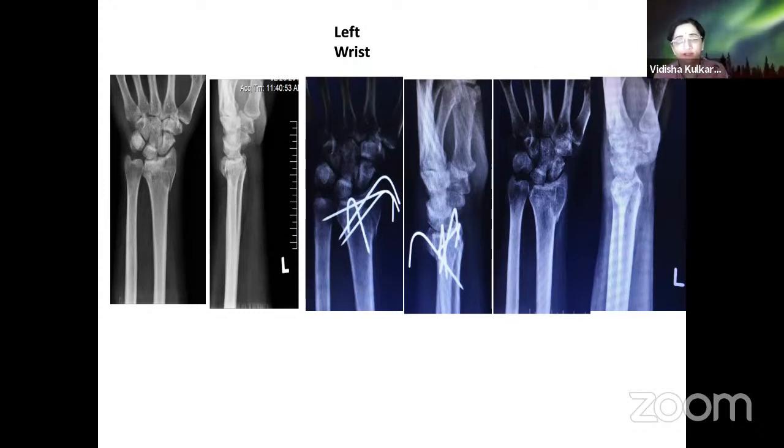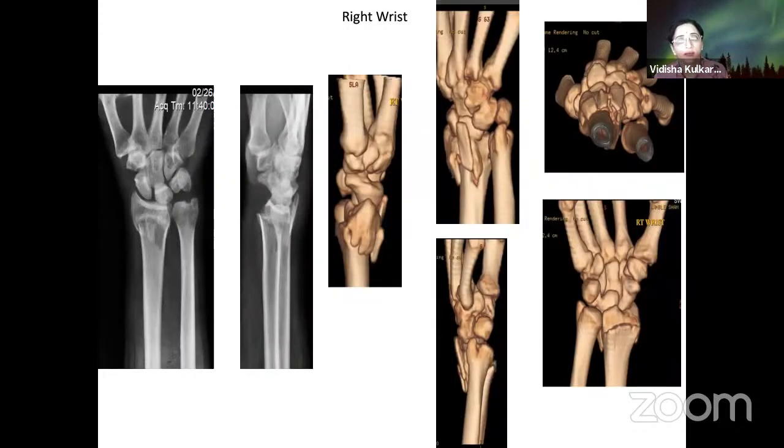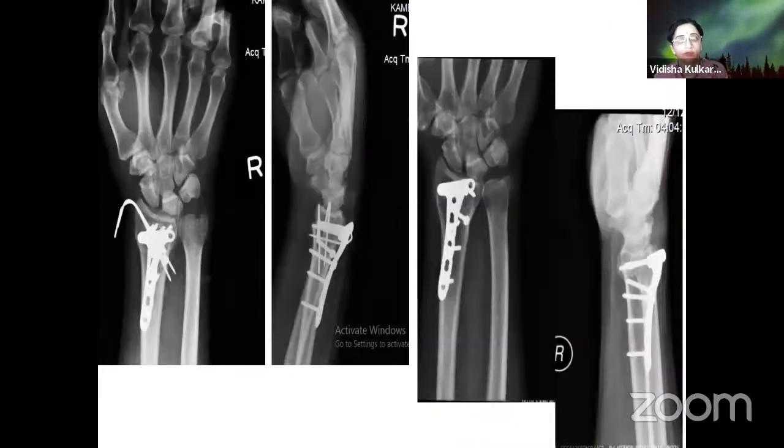So this is the X-ray of the left wrist and a follow-up X-ray of the same wrist. And this is the right wrist, which was treated with a volar plate applied dorsally. A juxta-articular plate was used to avoid the use of two plates. The Lister tubercle was trimmed, and with the addition of a radial styloid wire, the dorsal comminution was fixed with screws and plate.